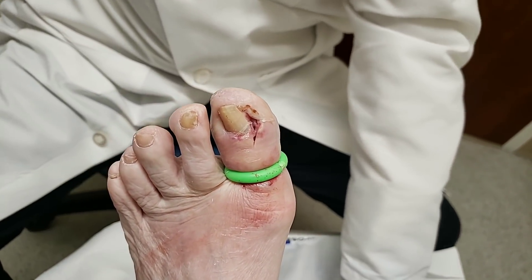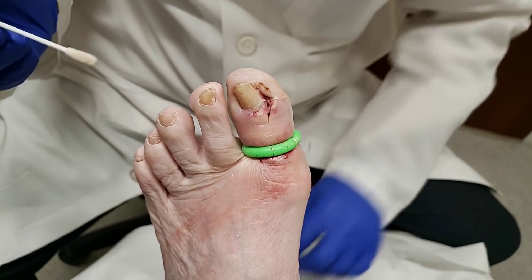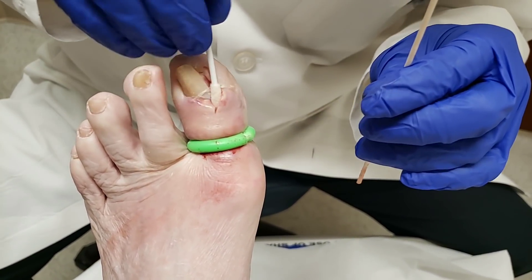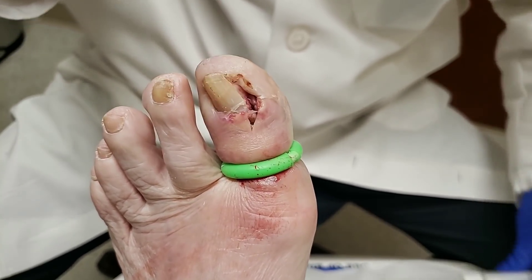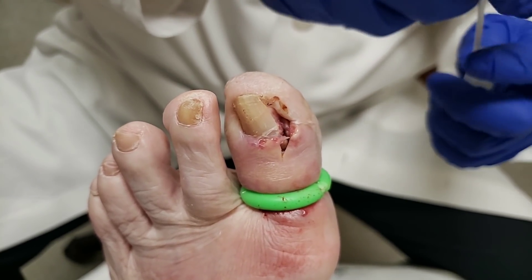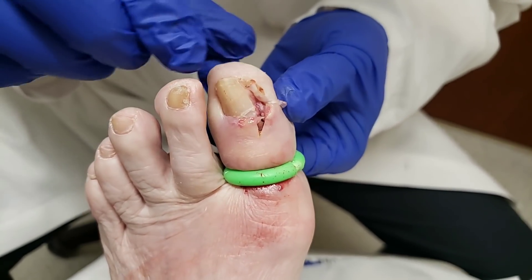I don't normally take cultures when I do these, but to make sure we're on the right antibiotic for this patient, I am going to take a culture. I want to get deep inside here and get a deep wound culture, trying to avoid the bone as much as I can. This will verify that we have the proper antibiotic. This isn't a typical ingrown toenail — normally it's easy, but this is one of the more challenging ones when it gets infected. We're going to send that off to the lab.